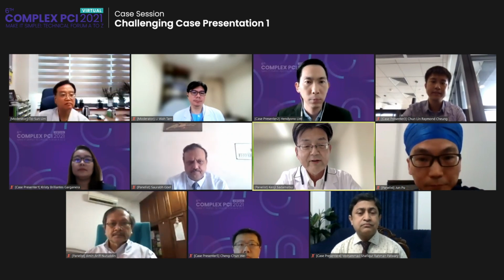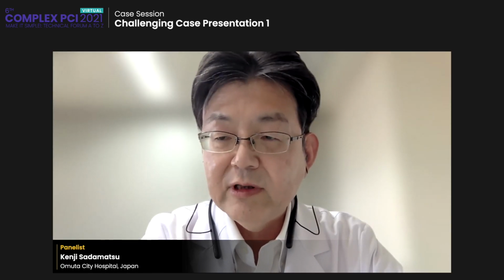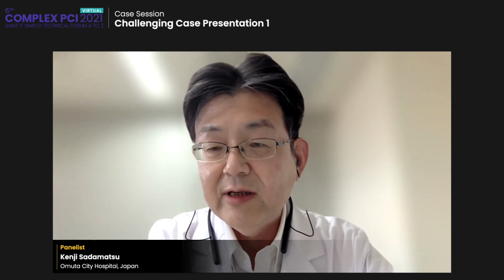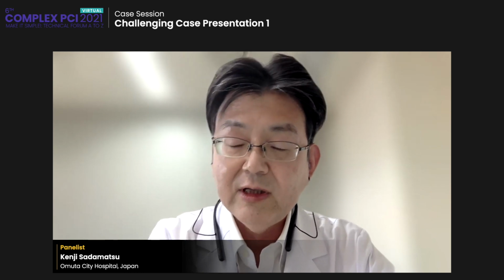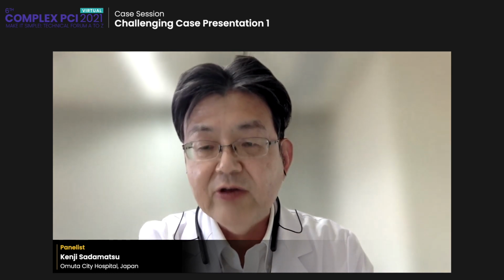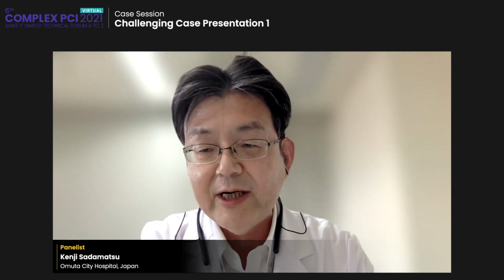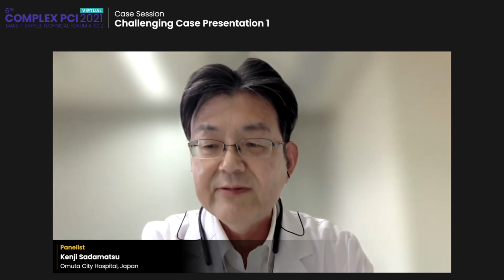Okay, I'm Kenji Sadamatsu from Japan. I totally agree that iFR is a very useful treatment guide for the LAD, but hemodialysis patients are excluded from all randomized studies using iFR, because resting coronary flow in hemodialysis patients is increased. So it is difficult to assess the resting flow in hemodialysis patients. Did you measure FFR in this patient?